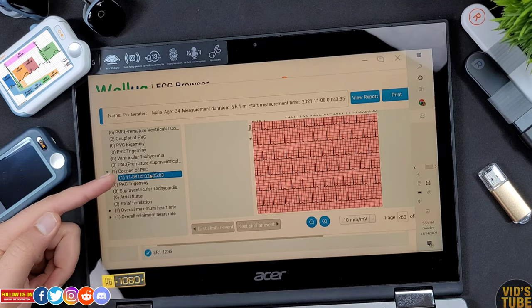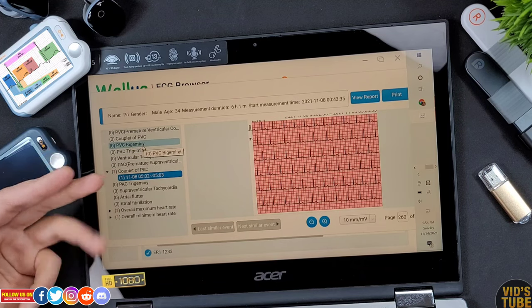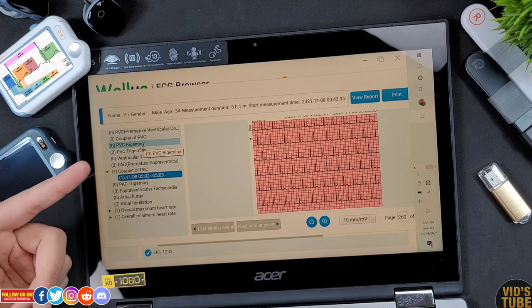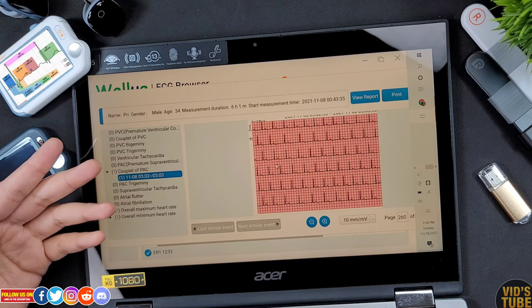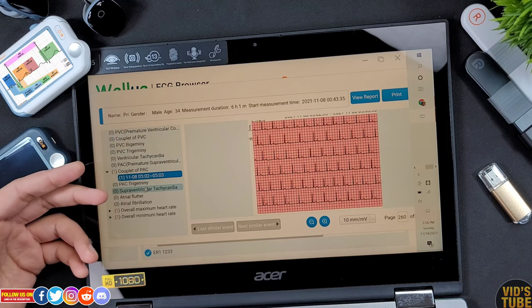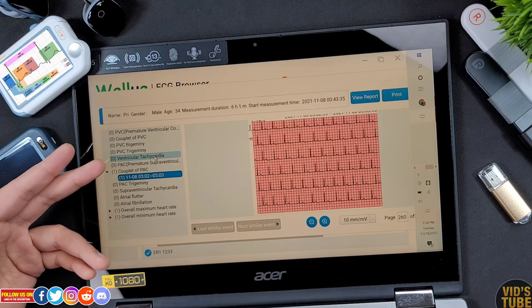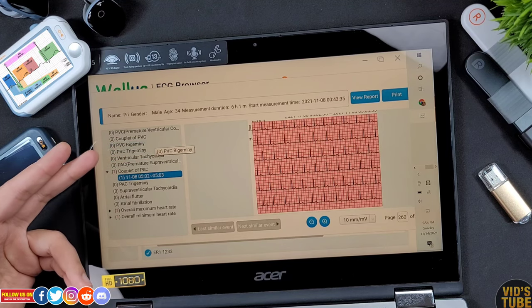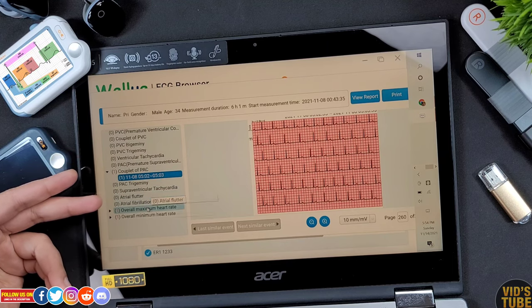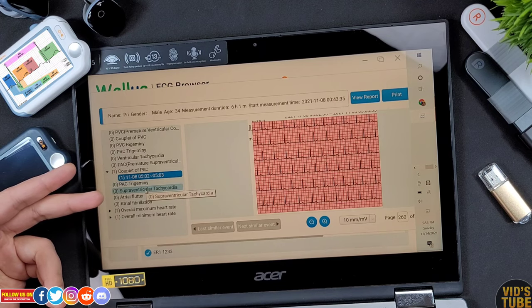In my case there was a couplet of PAC — premature atrial complex — and I can go directly to that specific segment. PVC is premature ventricular complex; bigeminy and trigeminy mean every other and every third beat is a PVC. All these are medical jargons and for a non-medical person it's better to talk to your doctor. Something of concern would be ventricular tachycardia lasting more than a few seconds, which can be life-threatening. The AI analysis also checks for atrial fibrillation, atrial flutter, and supraventricular tachycardia.